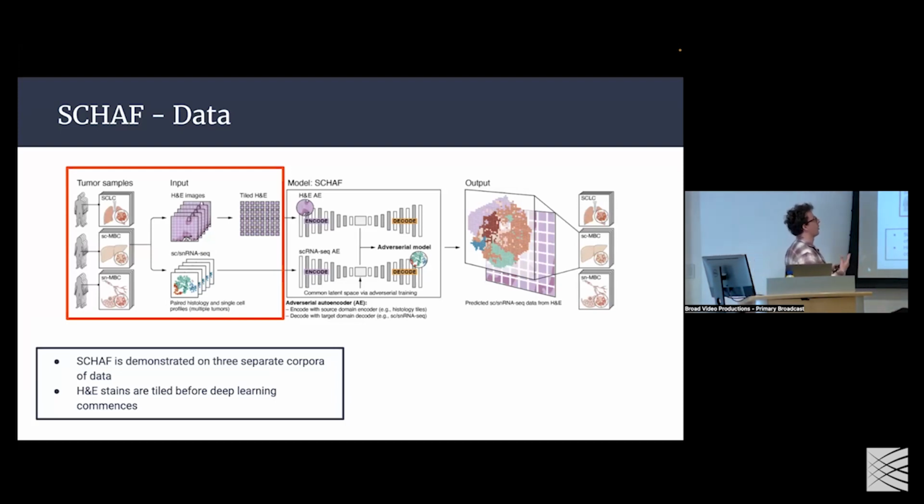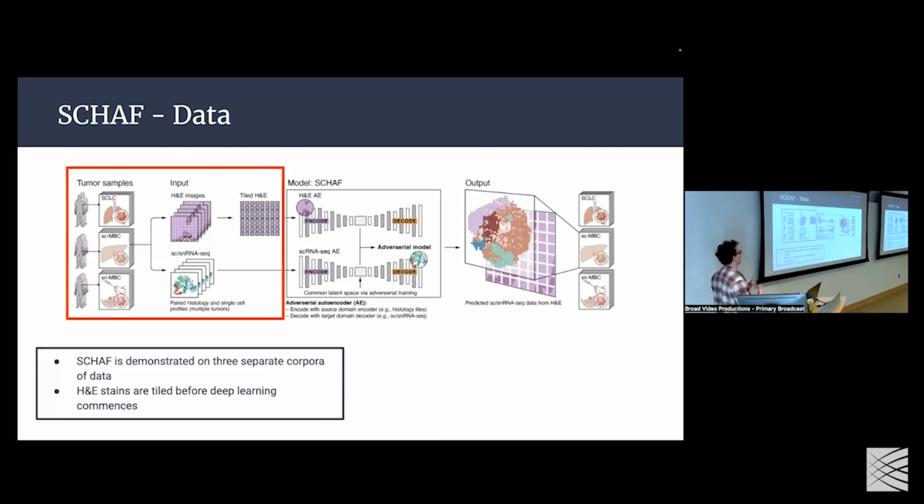again, we consider all 3 of these corpora to show that the model is robust to different types of data settings. Lung cancer has approximately 24 patients. I believe that both of the metastatic breast cancer corpora have roughly 8 patients. So that's the data setup. And for our actual model, the first thing we're going to do is take a histology stain like we see here, and we'd like to first get these single cell-ish types of representations from these H&E images.